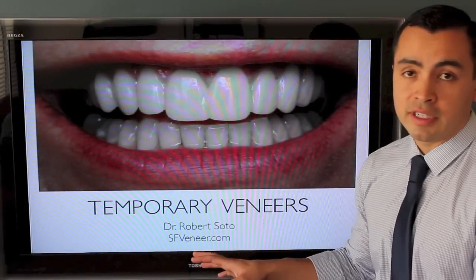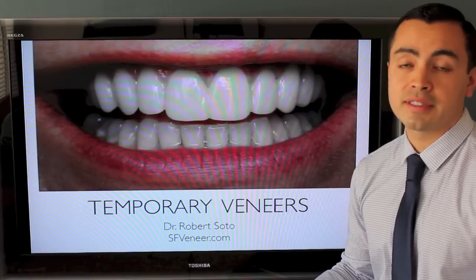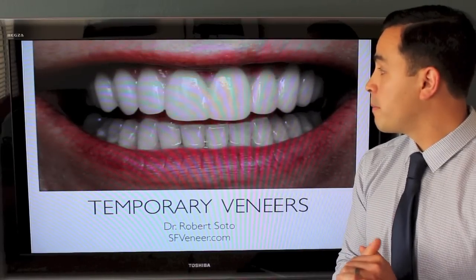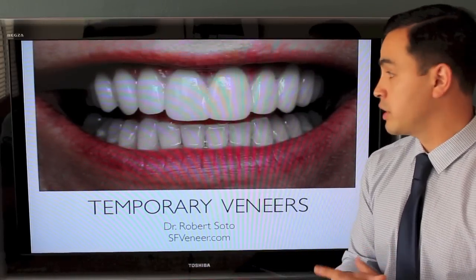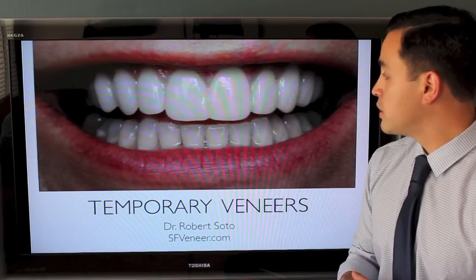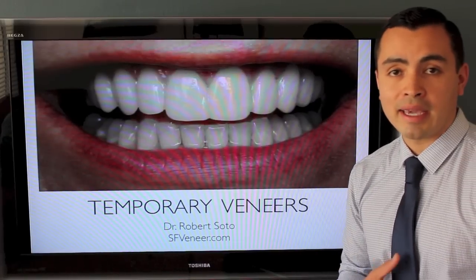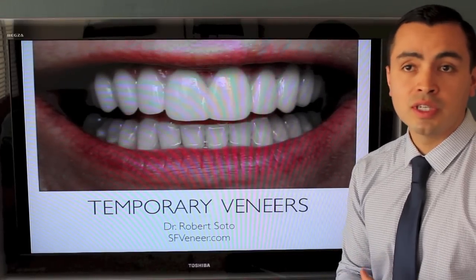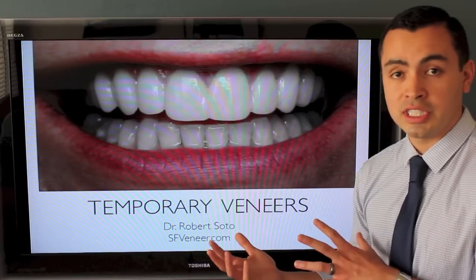These are the temporary veneers. The whole process usually takes two to three weeks. When the patient comes in for the preparation of her veneers, we'll prepare the teeth, take an impression, and send that to a laboratory so they can start working on the veneers. In the meantime, she'll be wearing temporary plastic veneers. These are only plastic so they can be shaped and contoured. I usually have the patient come back in about three days so we can change the shape if she'd like, and she can go home and talk to her family and friends and decide whether or not this is what she really likes.